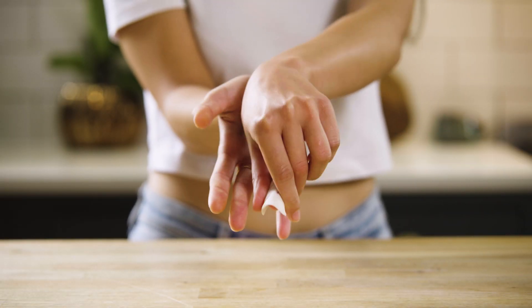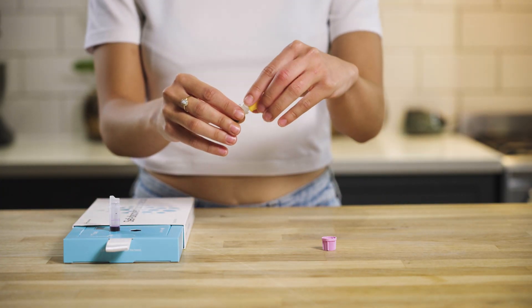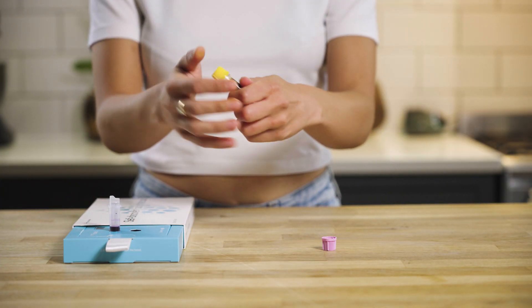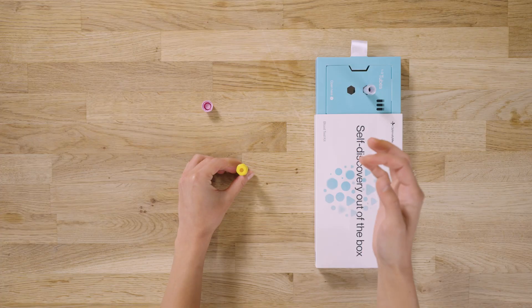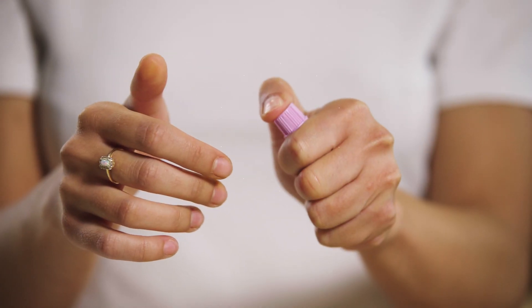Clean your finger with a wipe and pop on a plaster. Attach the correct colour cap to each tube by pressing down until they click. Depending on the test you're taking, you may have different coloured tubes. These need to be mixed in different ways.